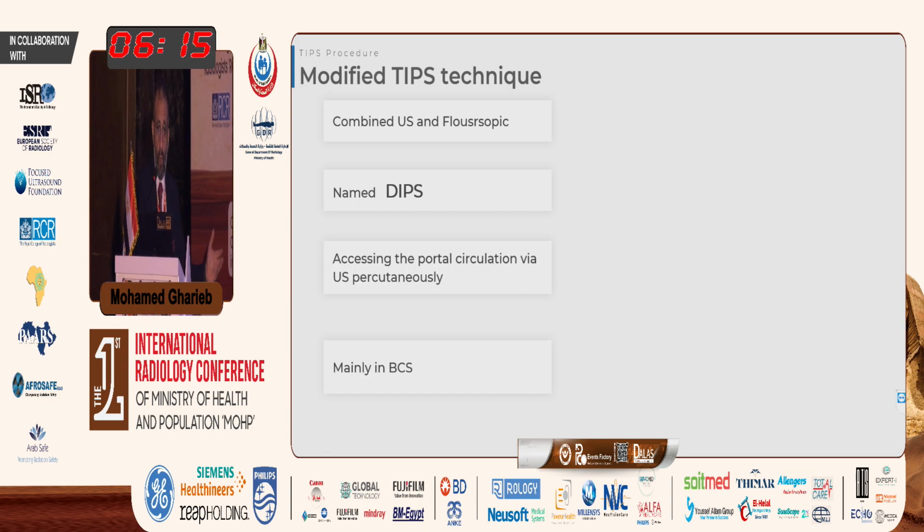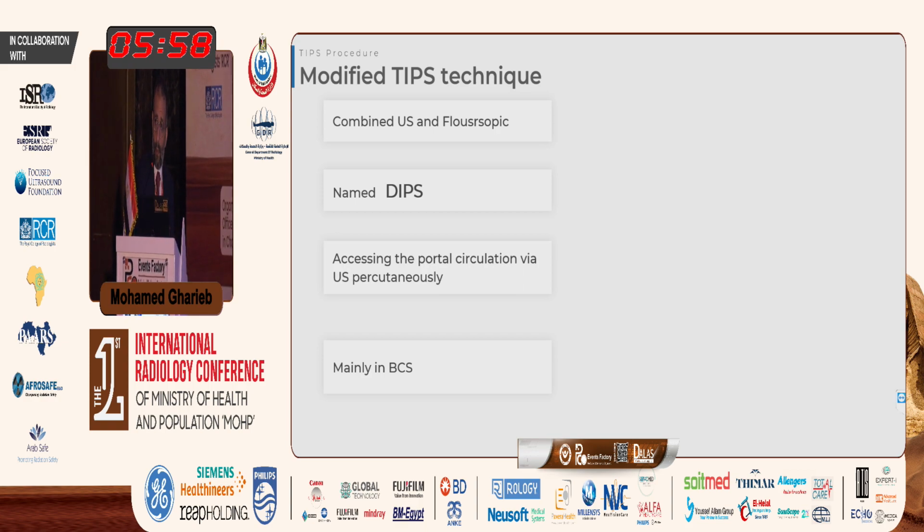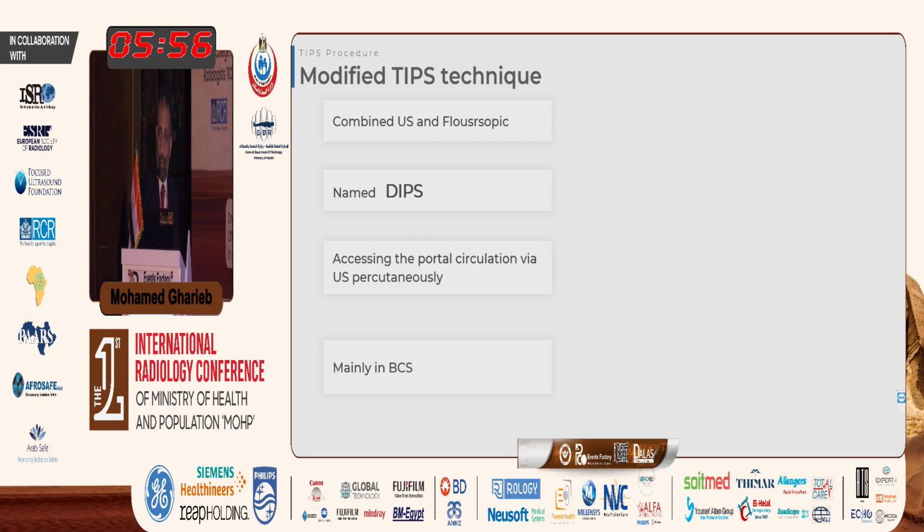Indeed, Dr. Mohamed has a very large experience in these cases, and he even punctures the portal vein from the end of the table, we know, without needles. But we see that combined fluoroscopic and ultrasonographic puncture of the portal vein and IVC may save time and fluoroscopy and give us good results.